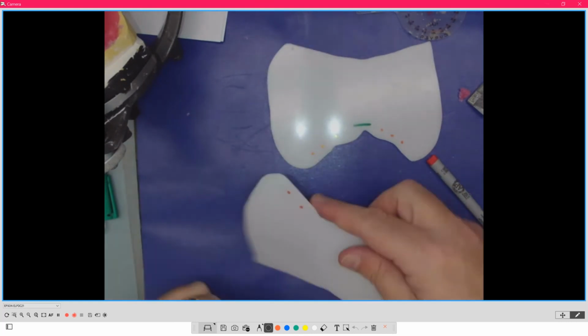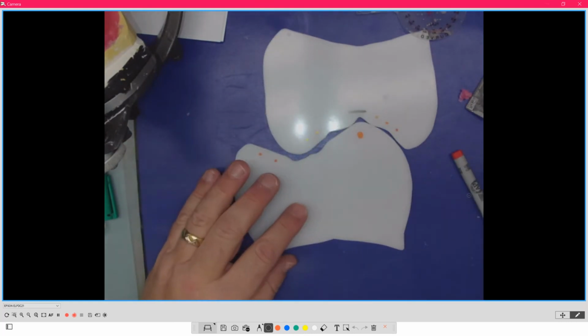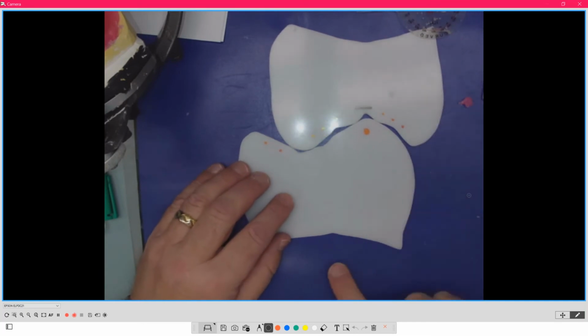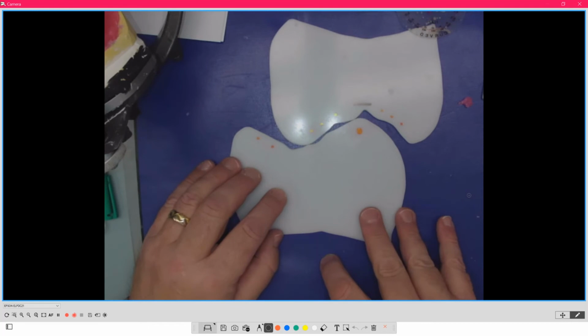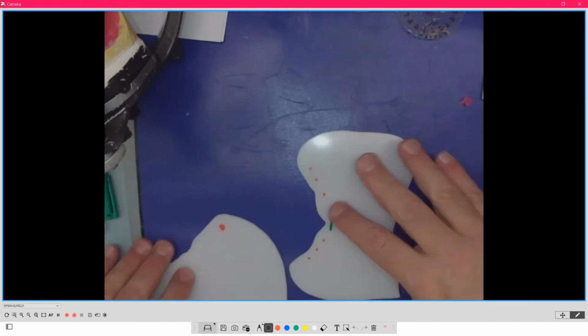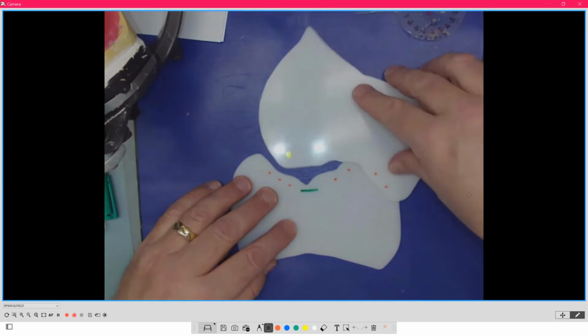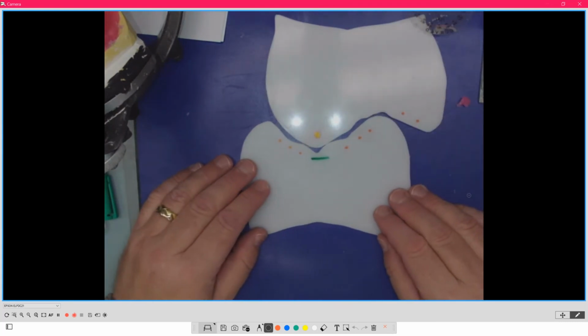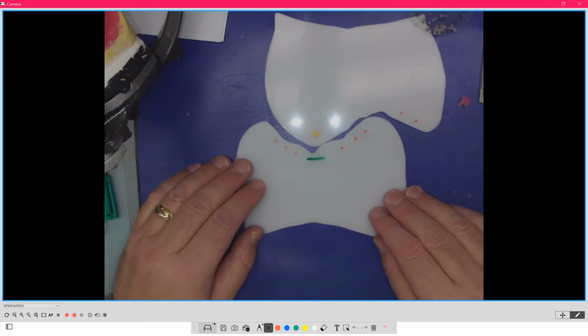And forgive me because this is a molar, but the point is this. If I set this, then I was off the ridge, right? And you could see that. But what's happening now is I can take this tooth and move it in a little bit, which is what I've done. The reason why I can move it in is, let's tip them the right way, Mark. Okay, so I can move it this way slightly.